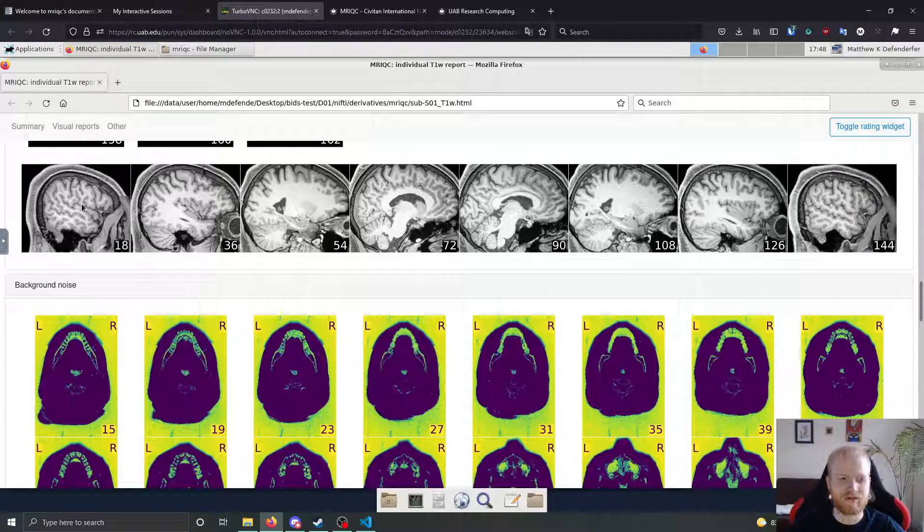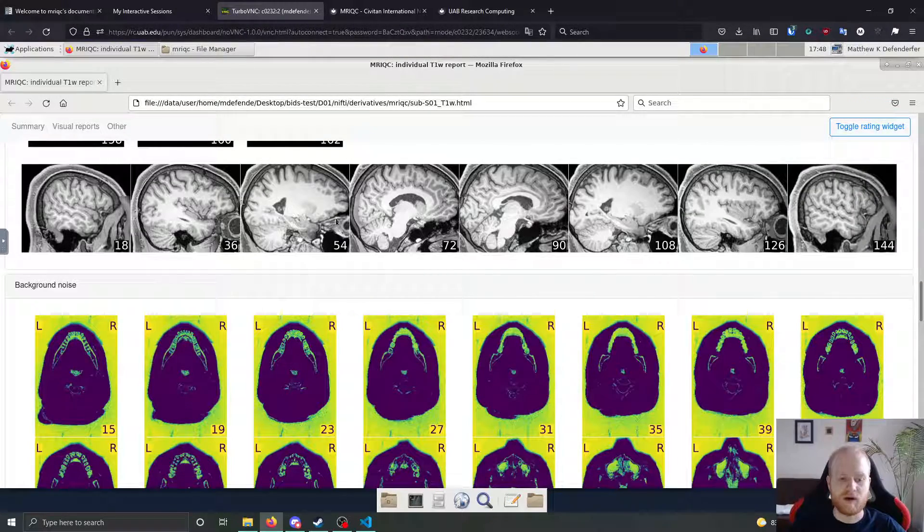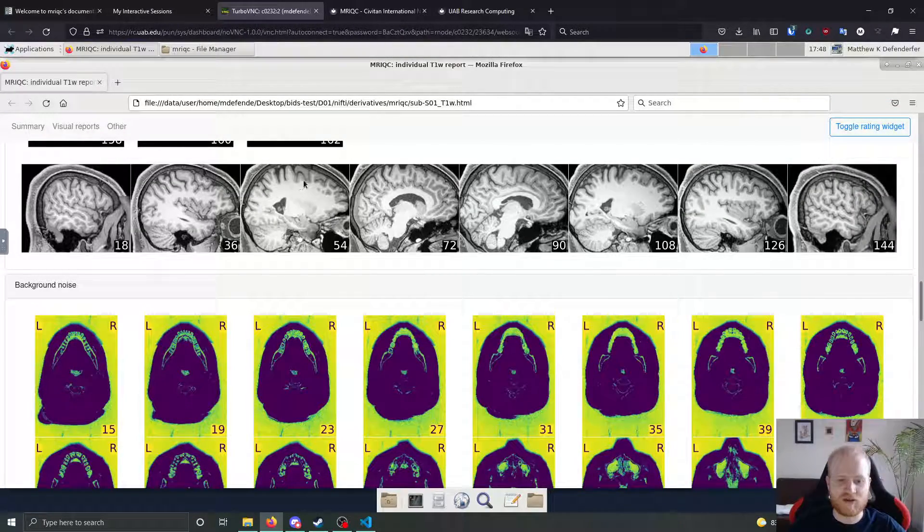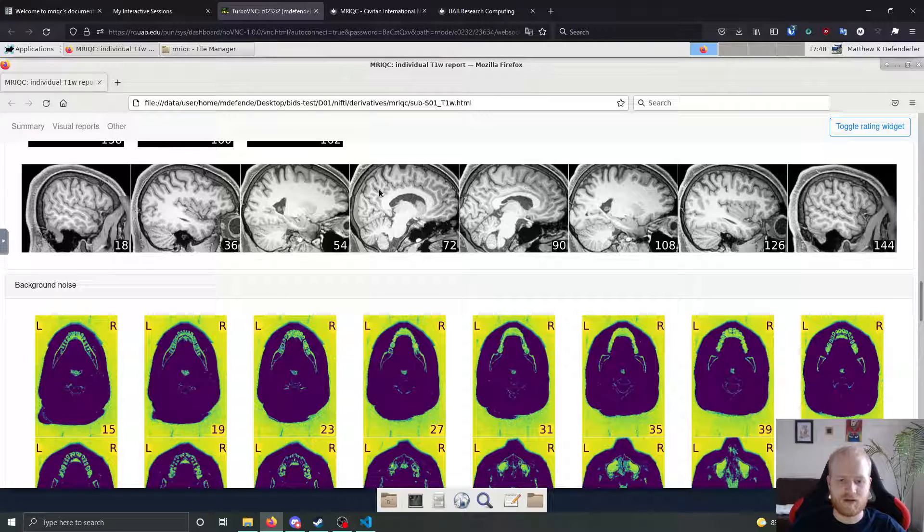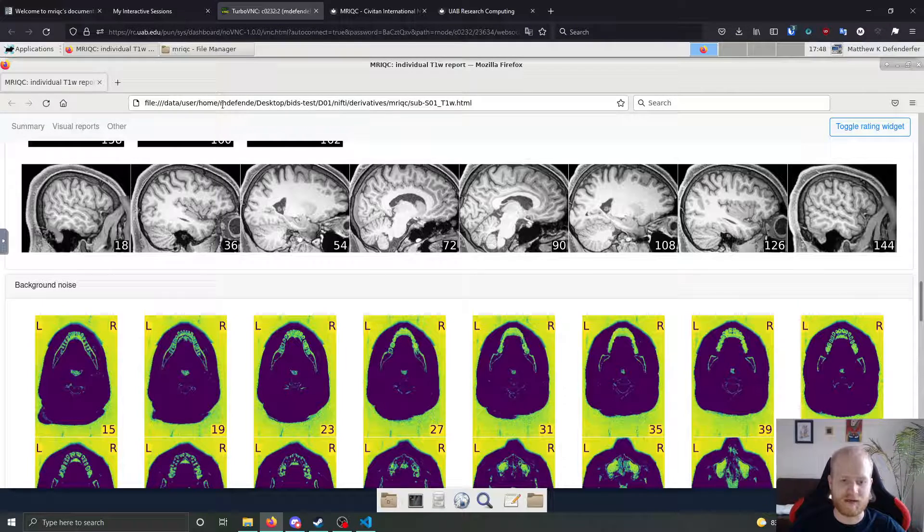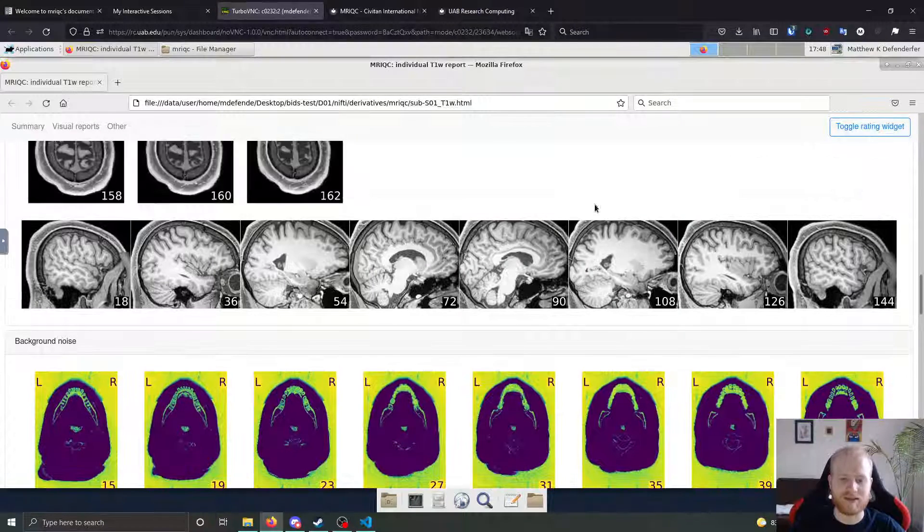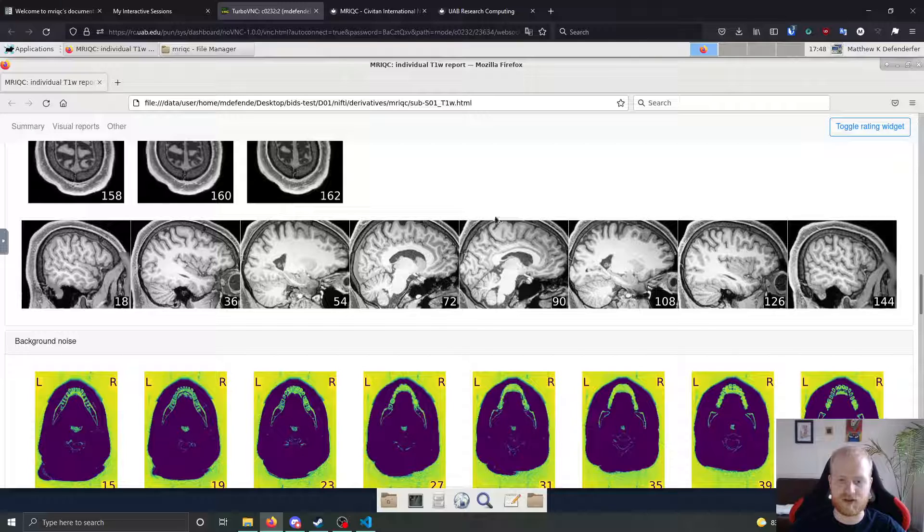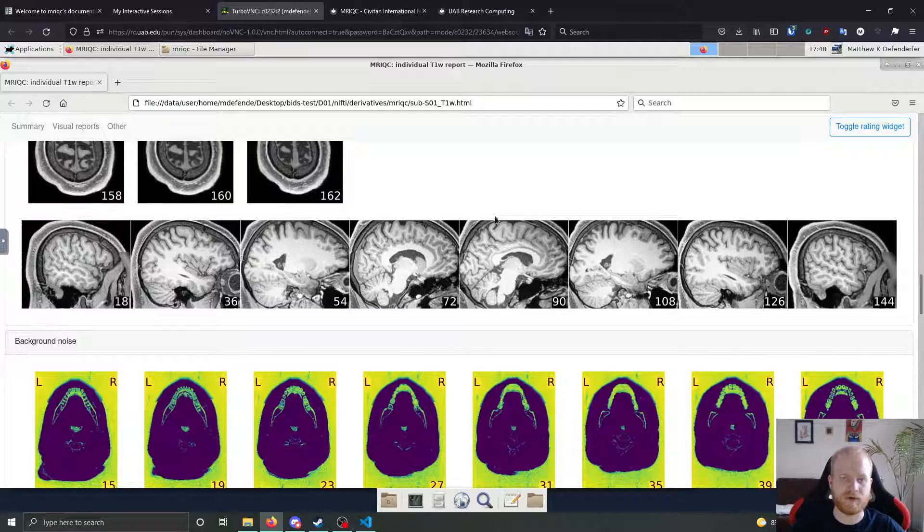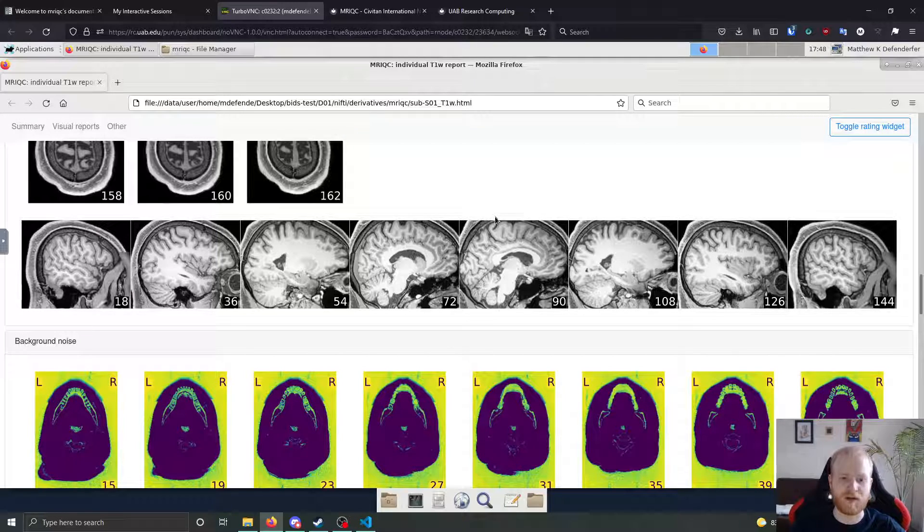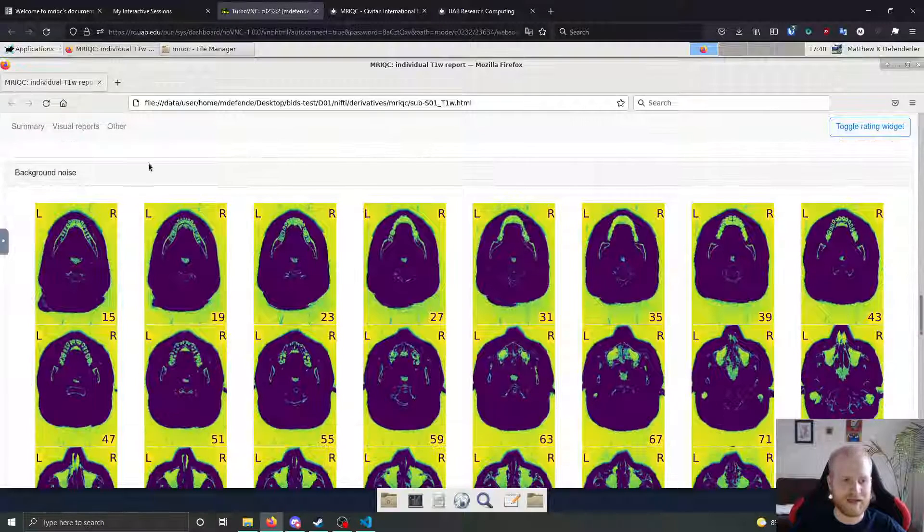It also gives you a few sagittal images to look at. Not as many as the horizontal, but both of these together gives you a good idea of just the general quality of the scan.